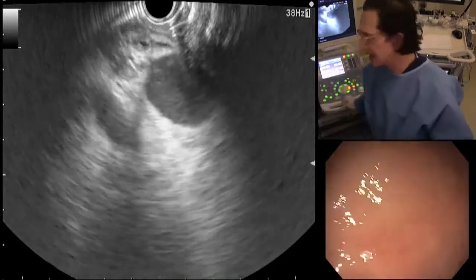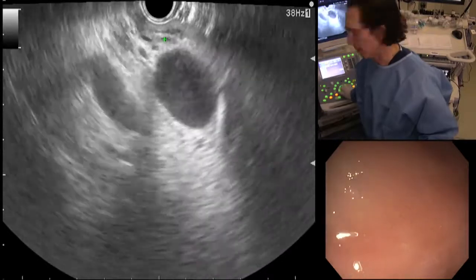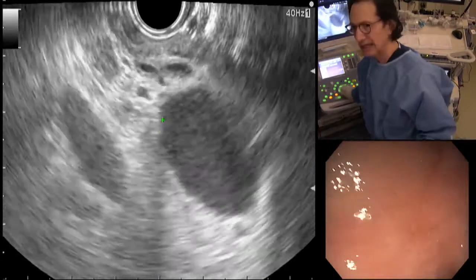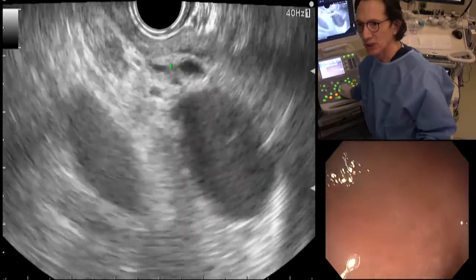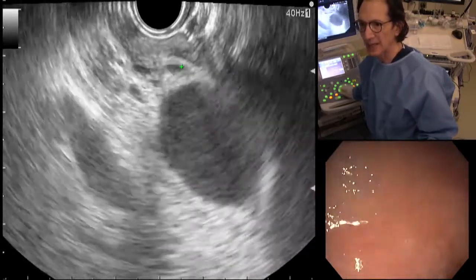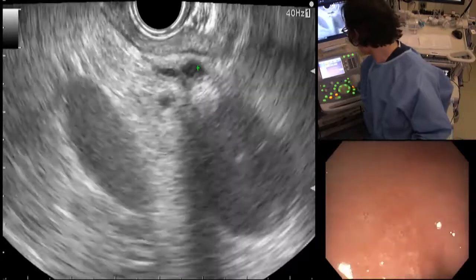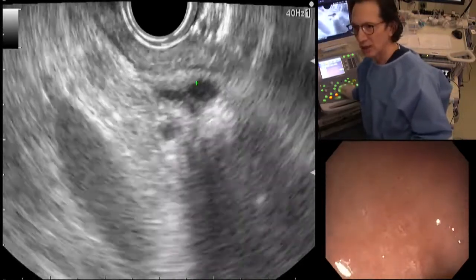And so we see then above the portal vein, there are a couple more structures here, and I'll mag in for you. They're tubular structures with anechoic interiors here and here. So when you see two structures like that side by side, the bet is that it's probably the bile duct and the cystic duct. And we'll see if this duct here joins this duct there. And we'll mag it up for you just a little bit more so you can appreciate that. So we have two structures here.